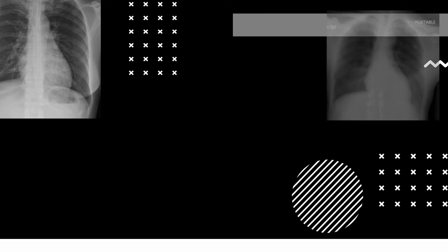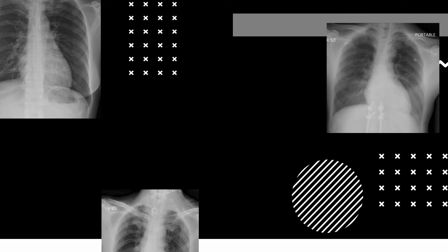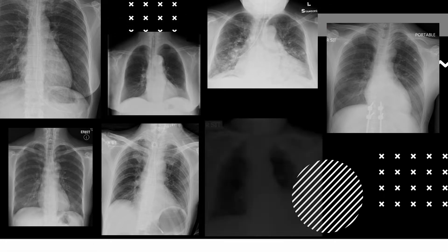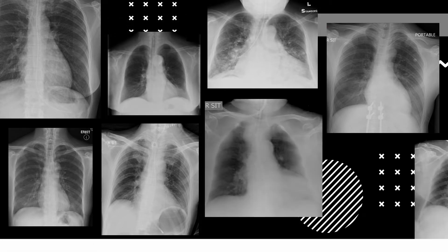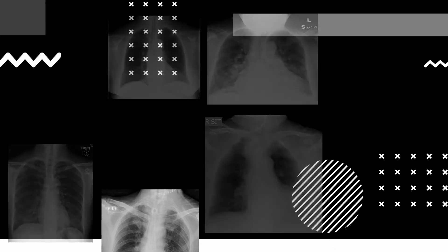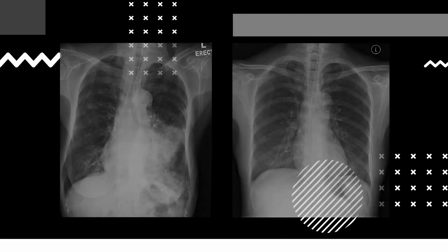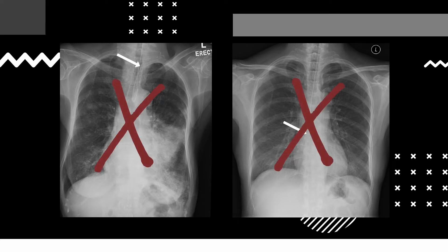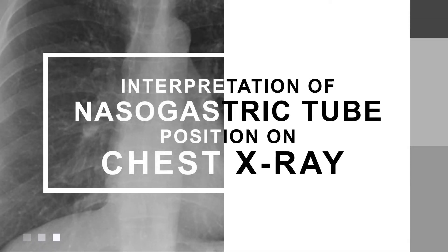Nasogastric tubes are widely used for gastric aspiration or decompression and for administration of medications or nutrition. However, inability to identify malpositioned tubes and the complications remains a major issue. Malpositioned tubes can be associated with the potential for harm, and prolonged hospital stay or inpatient death can occur as a result. This video will go through the process for confirmation of normal nasogastric tube position on chest x-ray.